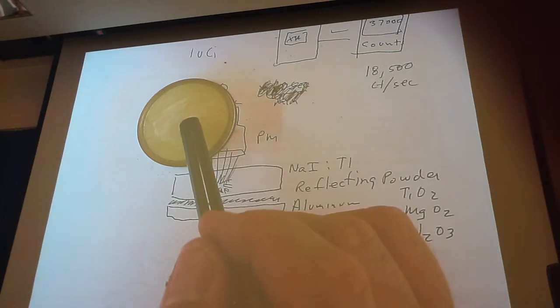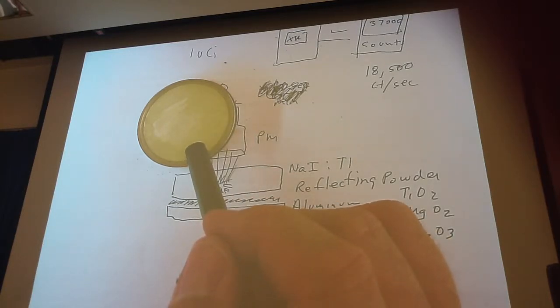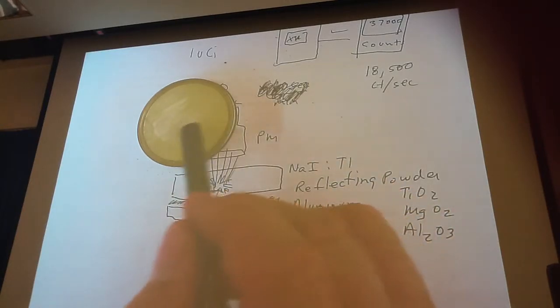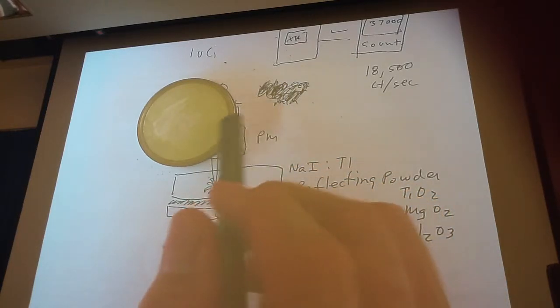Physical dropping of stuff, you know, we have these repair guys come in and replace light bulbs. One of my collimators got damaged. Of course, they didn't tell us. They dropped one of the fluorescent lights. Next morning, we had a cold spot where the septa had been damaged. So that's why it's a good idea.